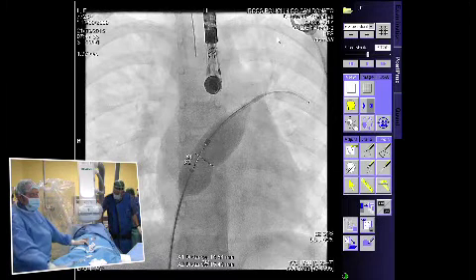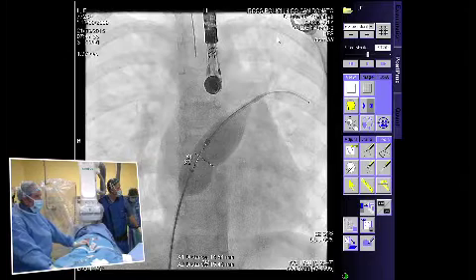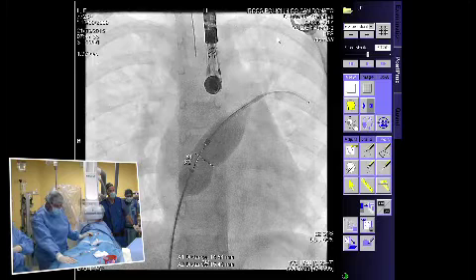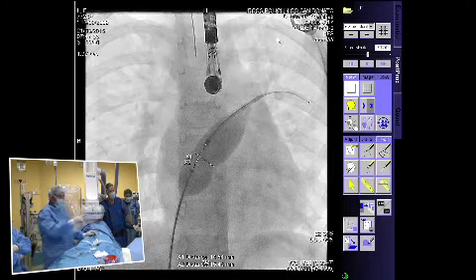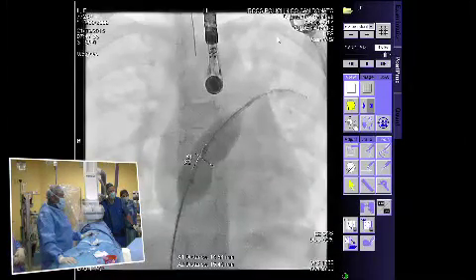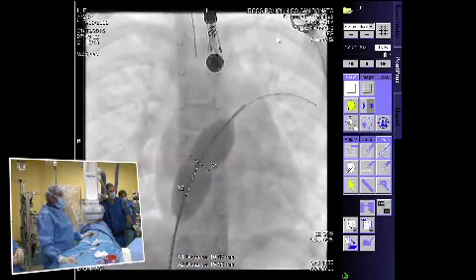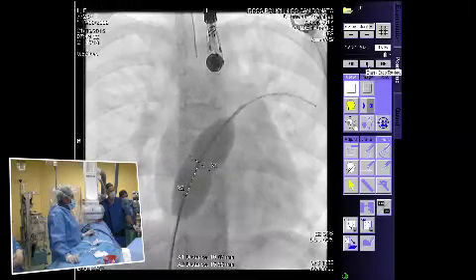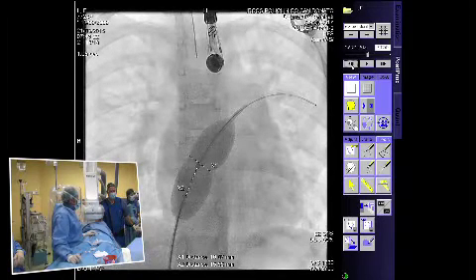Mario, this is Mansour. There are the two measurements. One of them is between the two dots, and one is the stretch diameter. The stretch diameter is the smaller one, I take it? Well, actually, you see an indentation, but it is not the really stretched diameter, because you see now the balloon going back and forth very easily with almost no pressure. And there was indeed an indentation, but without stretching anything.